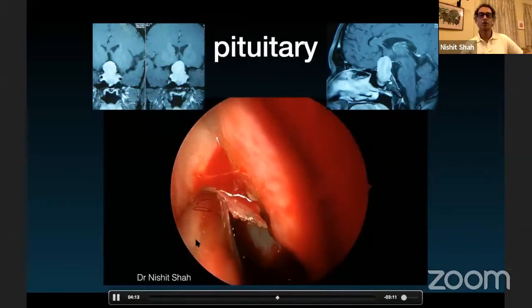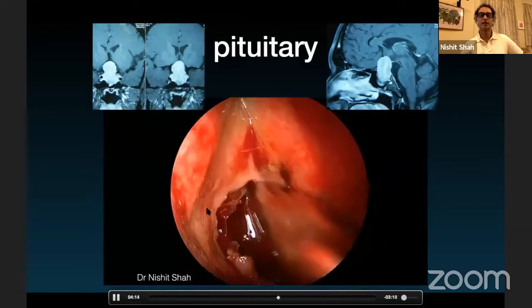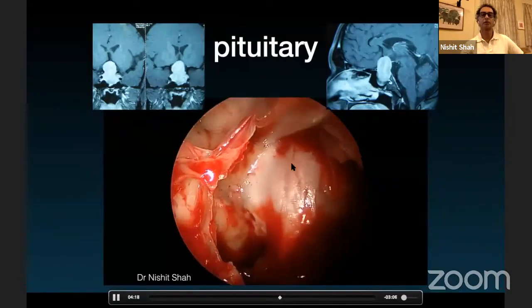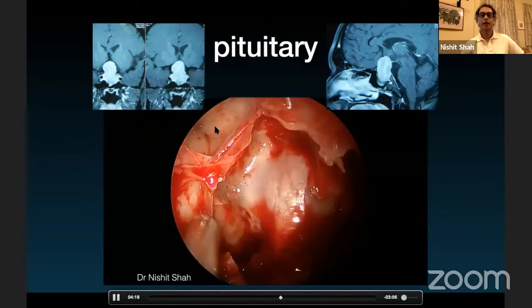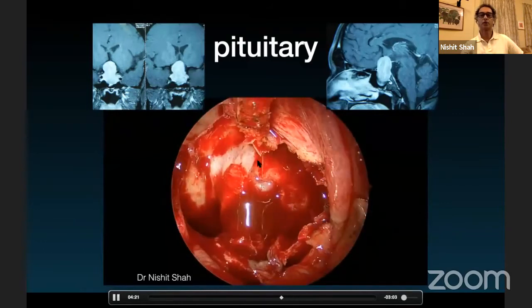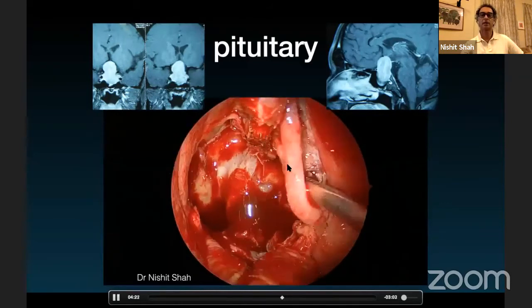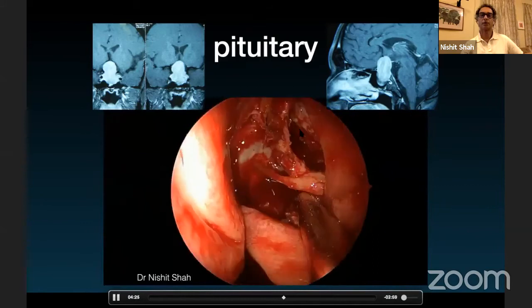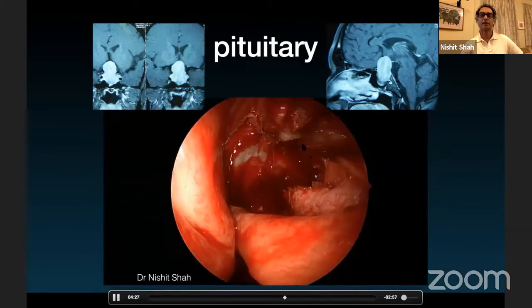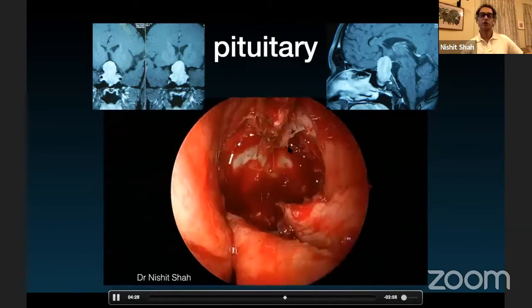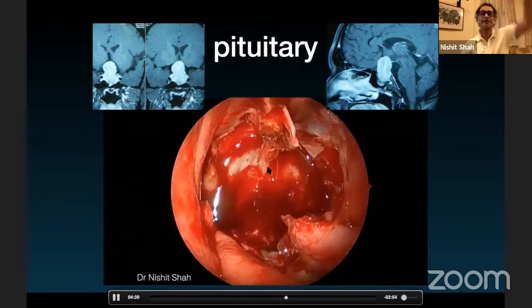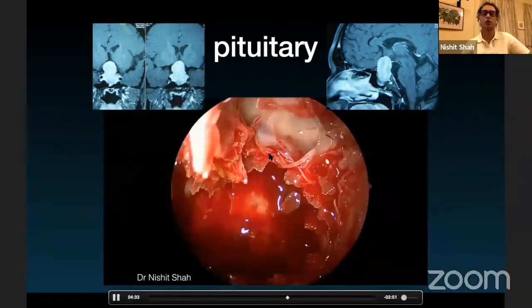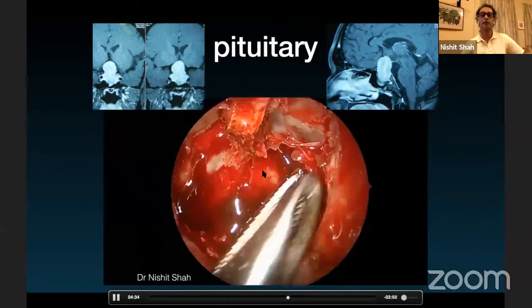The mucoperiosteum is taken off the posterior septum, perpendicular plate, and vomer all the way inferiorly, maximizing the incision to the bone-cartilage junction. The same is done on the opposite side. Even if you have a septal spur, always attempt to elevate without tearing — if you have a tiny tear not affecting blood supply and not in the reconstruction area, you could still use that side for a flap. Once the posterior septum is cleared on both sides, dislocate the bone from the cartilage and remove the posterior septum in one intact piece for potential use in sella reconstruction.